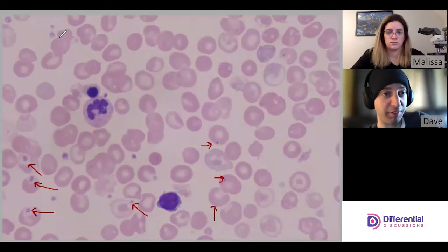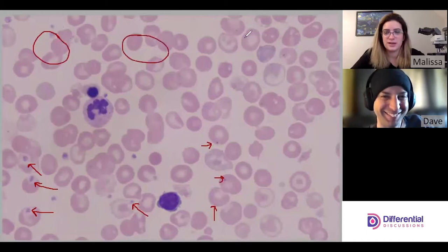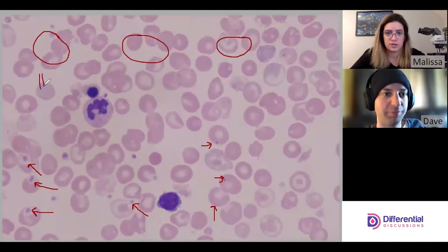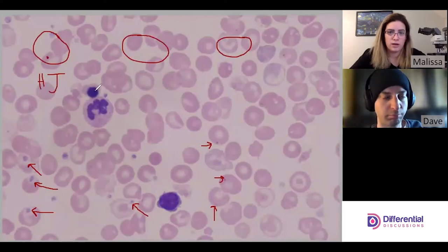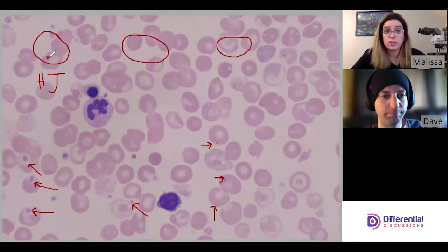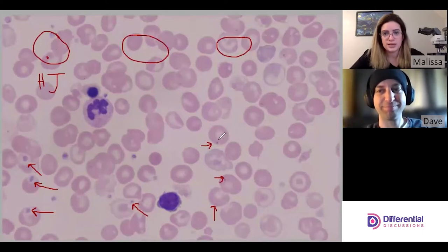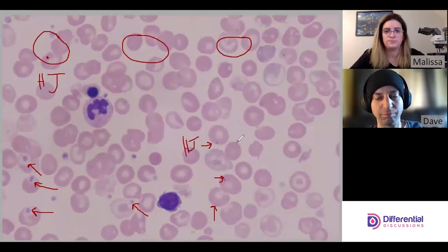There are three major types of red cell inclusions. First are Howell-Jolly bodies — HJ for short. Howell-Jolly bodies are fragments of DNA and they're typically a dark purple-blue color, the same color as the NRBC nucleus. There's usually only one per red cell, occasionally two. This cell here looks like an HJ — just that single dot, all on its own.